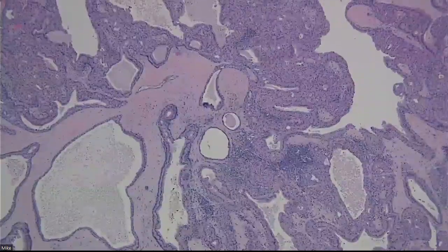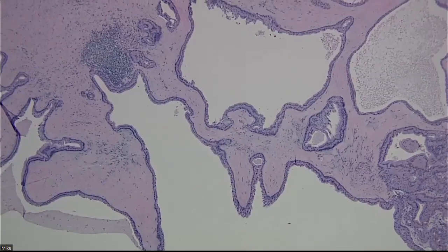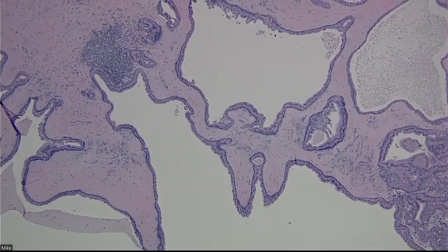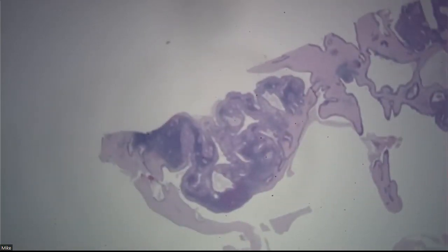But go ahead. Sorry, when I was looking at it first, I didn't come across these during my service. One thing in line with what you just said was I wasn't sure whether it was neoplastic versus reactive, from someone who doesn't have any knowledge. Right. But then my question is, grossly, does it actually form a mass? It's a mass. Okay. Grossly, it's mass forming.